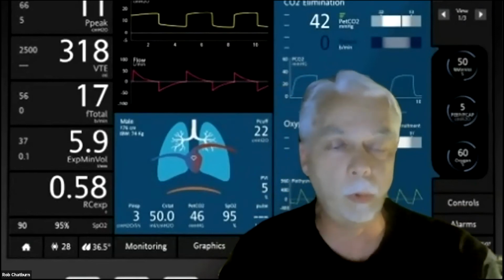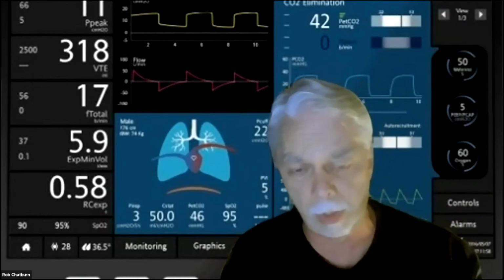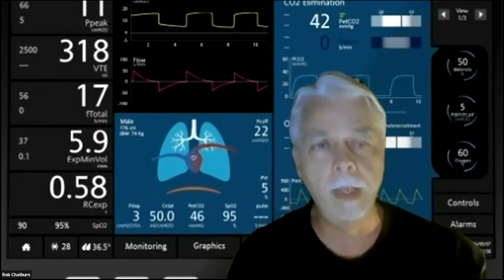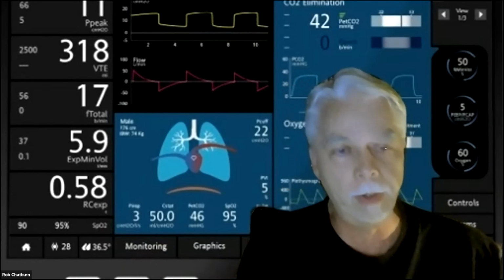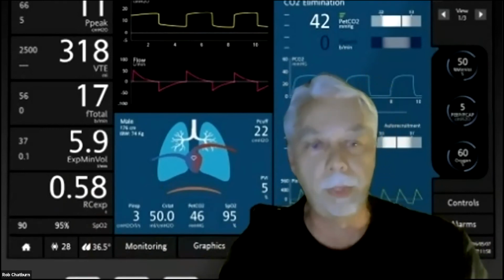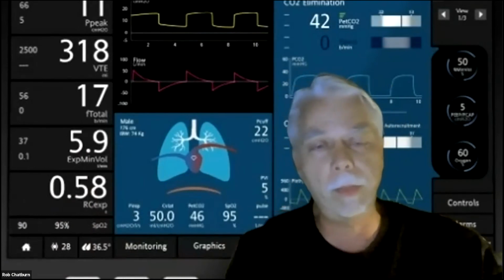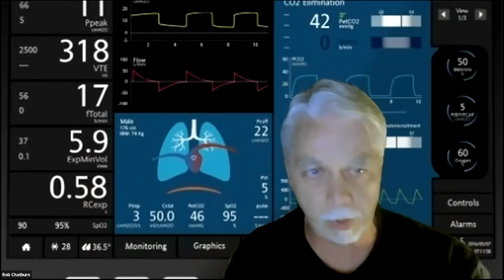And the blood gases will reflect the disease state, whether it's a normal lung or COPD and ARDS. I've helped him to validate that model. And Ingmar is looking to integrate the physiology simulator into their mechanical simulator. So that would be the next step. Then if you have a dual compartment model where each has its own VQ ratio, what's going to happen in terms of mechanical power distribution for a given level of alveolar ventilation and blood gases that you want.